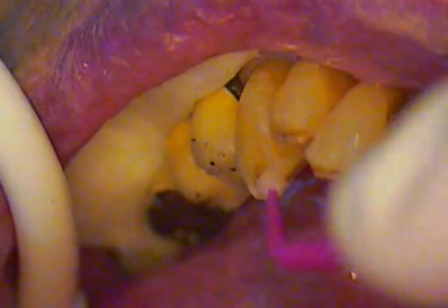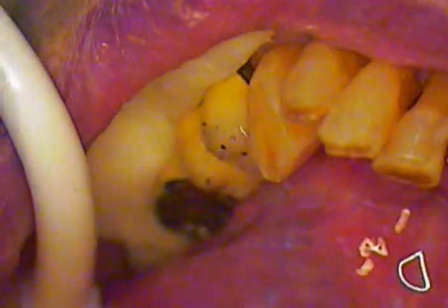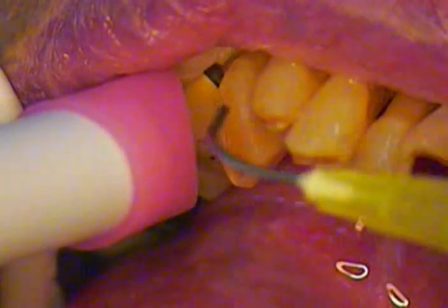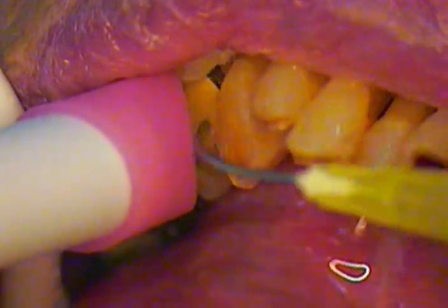I'm going to add consecutive layers of this primer, and in between the three to four coats we'll suction off any of the solvents. We'll just dry that surface lightly. The next step is to add the dentin bonding resin. I happen to use All Bond Three — I was very comfortable with All Bond Two for many years, then the company suggested three and I went with it. Two to three years in, I'm very comfortable with the results, especially minimizing post-operative discomfort under buildups and crowns. I'm ready to light cure that.